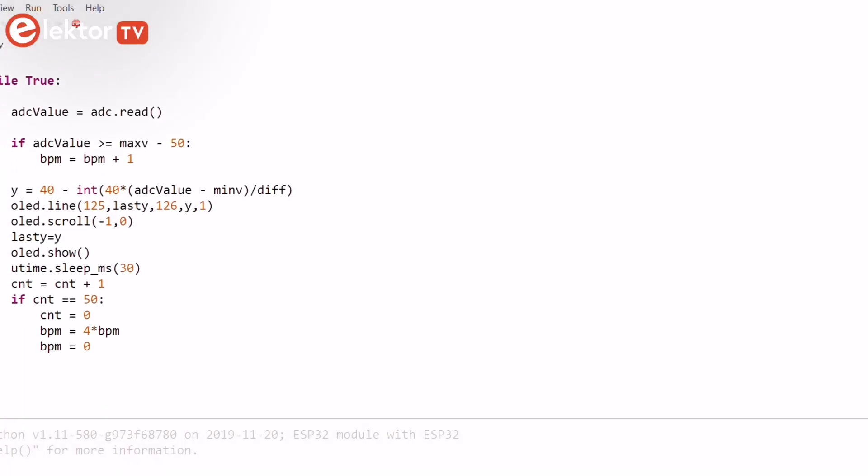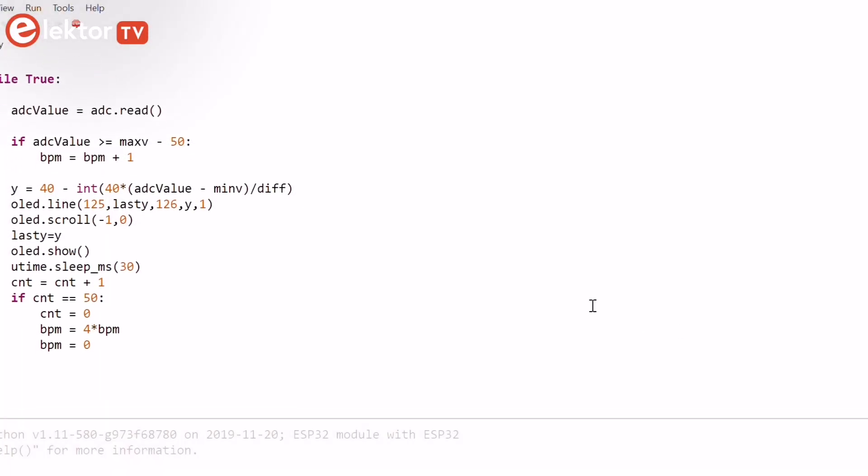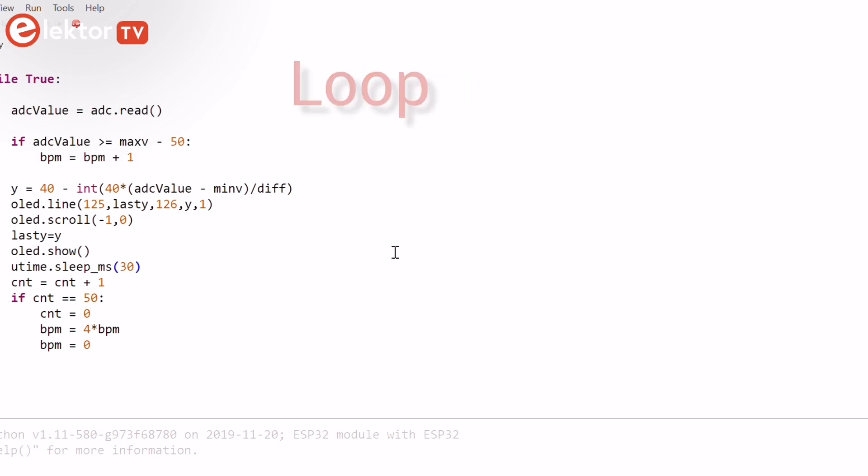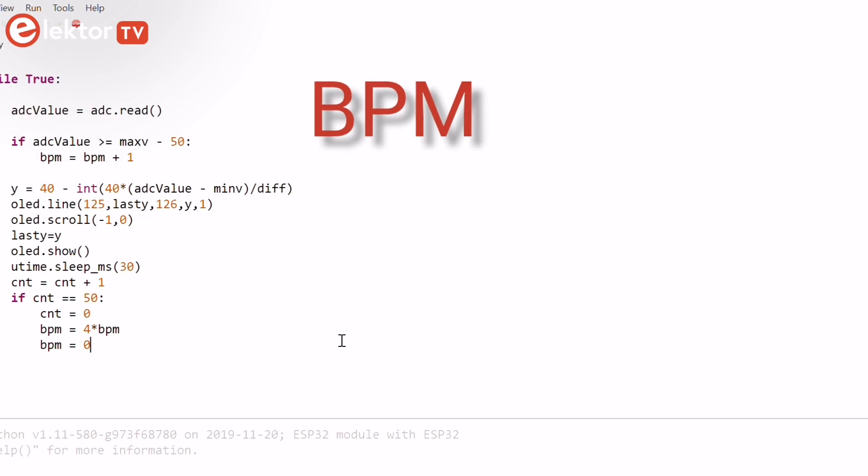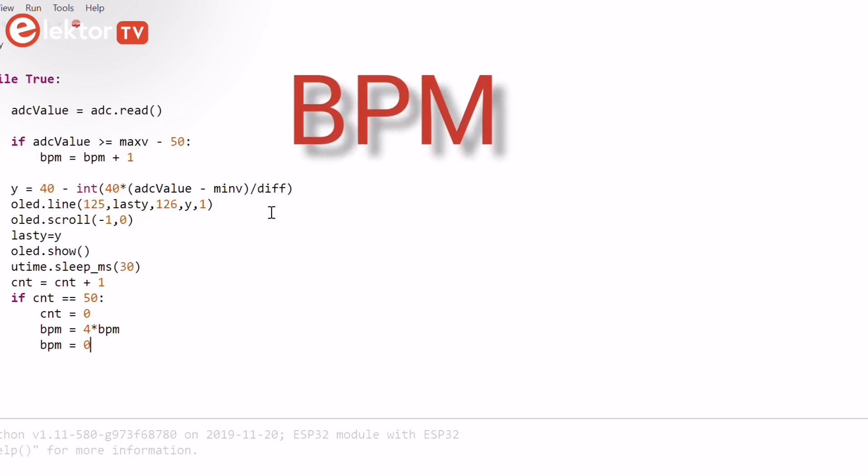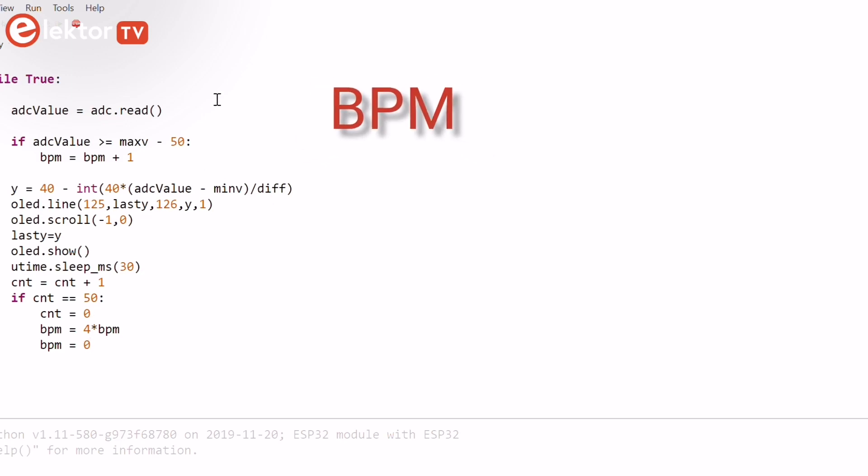The rest of the code runs in an endless loop setup using a while statement. Inside this loop the output of the pulse sensor is read and the beat per minute is incremented if the signal exceeds the threshold. This threshold is used to calculate the beats per minute.